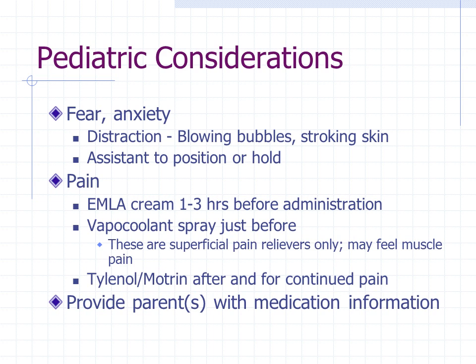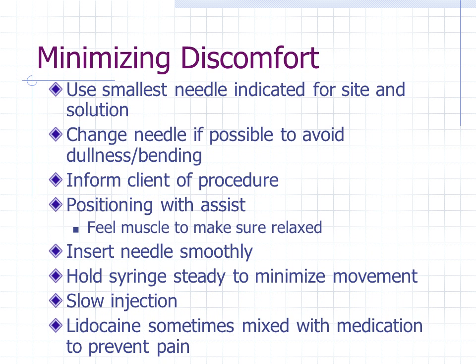Minimize discomfort by using the smallest needle indicated for the site and solution. Again, change the needle when you can to prevent dullness of the needle or bending of the needle. Inform the client of the procedure, position them, make sure that muscle is relaxed.